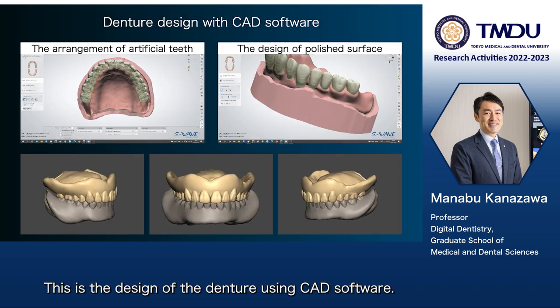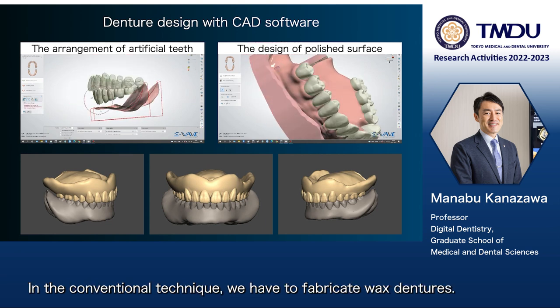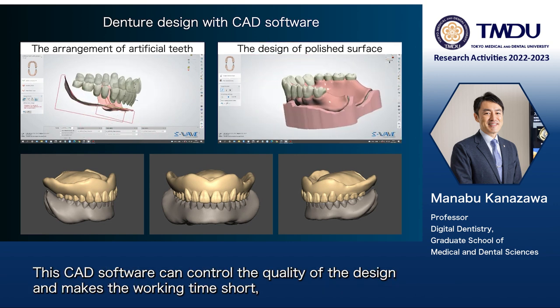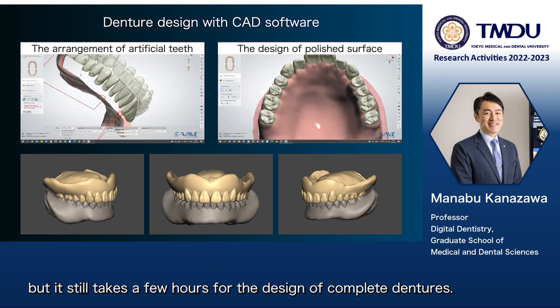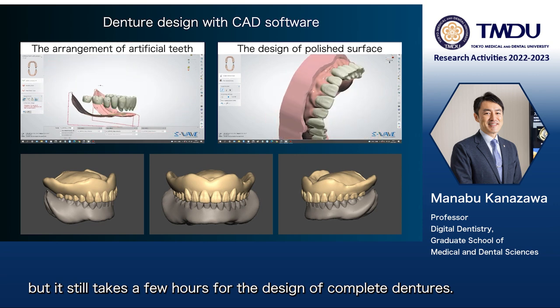This is the design of denture using CAD software. In the conventional technique, we have to fabricate wax dentures. This CAD software can control the quality of the design and makes the working time short. But it still takes a few hours for the design of complete dentures.